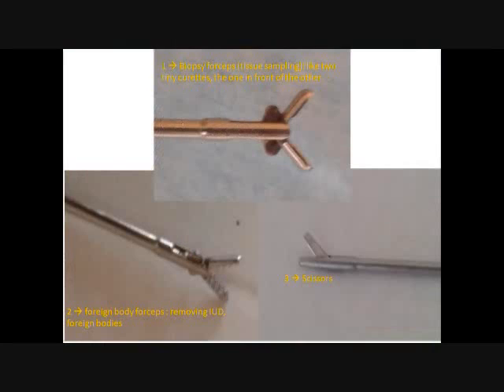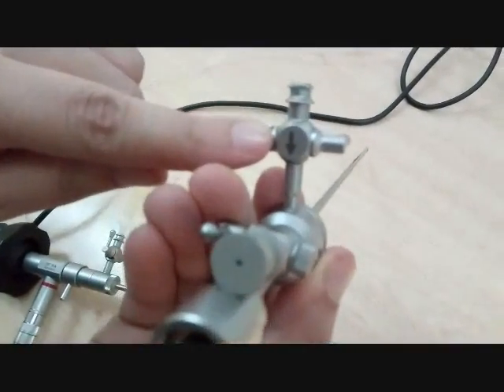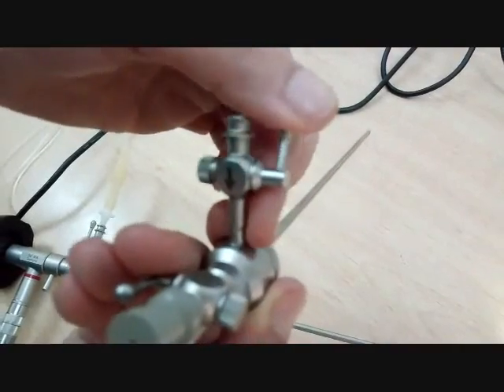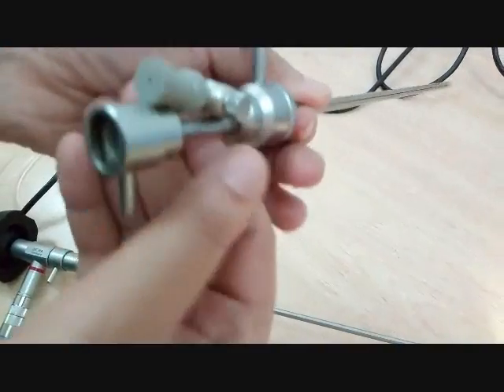For the mechanical procedures, 3 instruments are enough. A biopsy forceps up. It has the form of 2 curettes. Down you have a foreign body forceps and scissors. Here's an operating inner sheath with the irrigation connector and the stopcock. Here we close it. And here's the working channel.